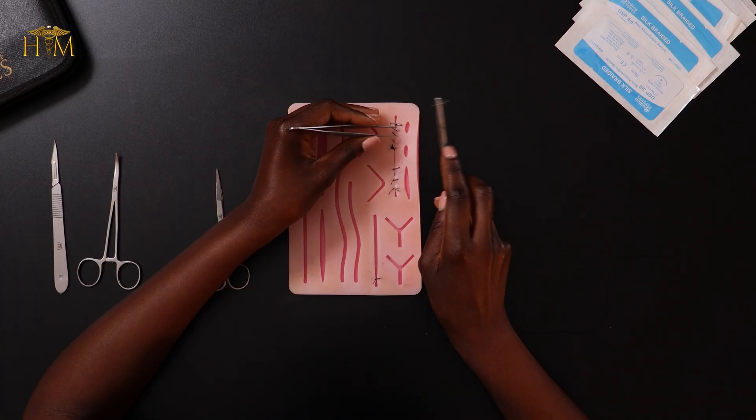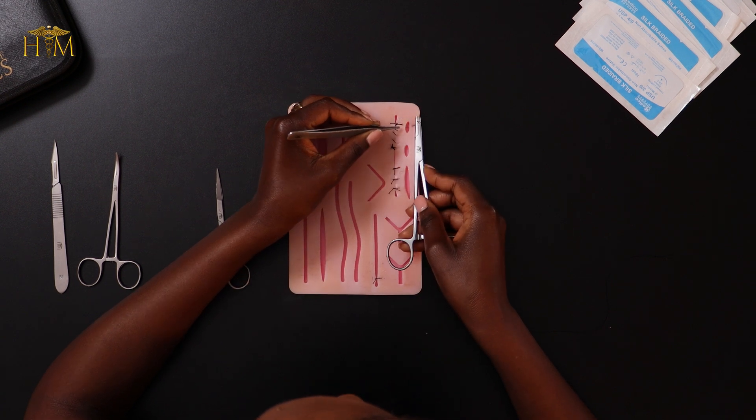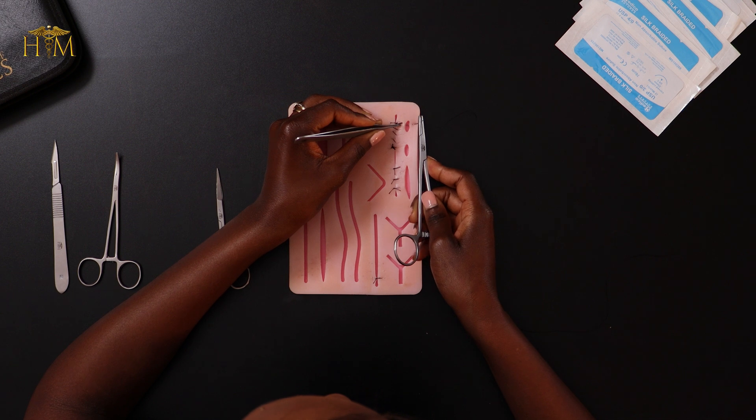I'm starting with my needle positioned in the right place on my needle holder and I'm going to put my forceps in my left hand. I've got my wound here and I'm going to start the same way we always start — advancing the needle about a few millimeters away from the edge of the wound, going in and advancing to the other side.